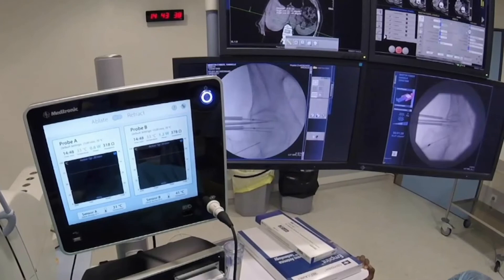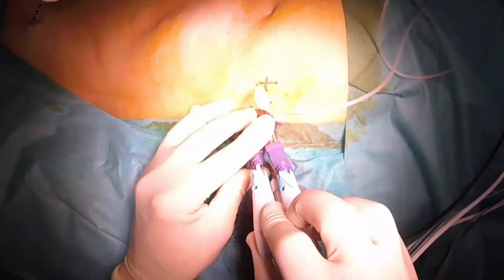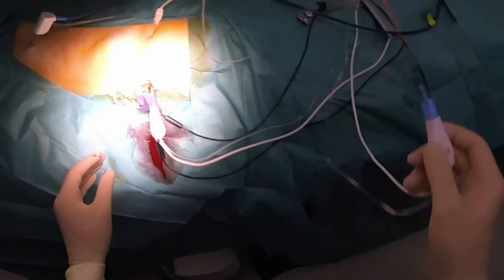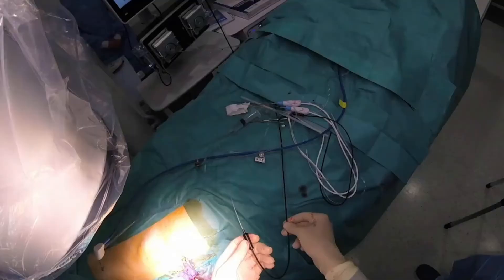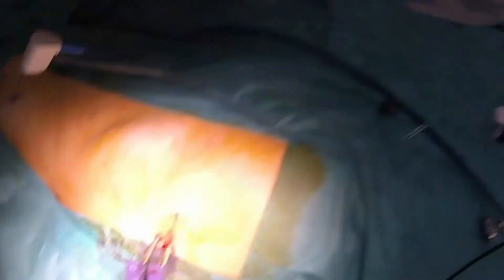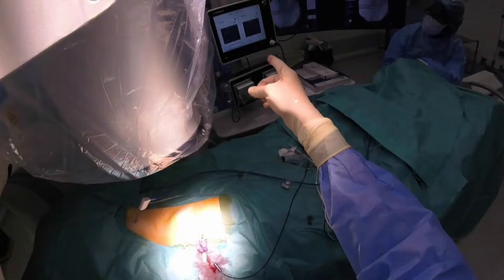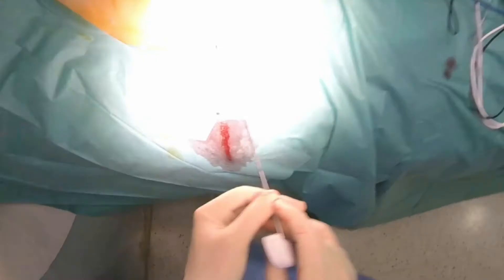In the same way as before, ablation will be stopped once the temperature near the cartilage reaches 60 degrees. Once ablation has been completed, cementoplasty is performed to ensure bone consolidation. The two bone introducers are slightly advanced over the RFA probes, and then the RFA probes are retrieved. I wait a little bit and then introduce a thermal sensor within the ablated area to check the temperature, because if cementoplasty occurs too early, cement might set too fast due to the high local temperature. After 5 minutes, temperature has decreased to 40 degrees.